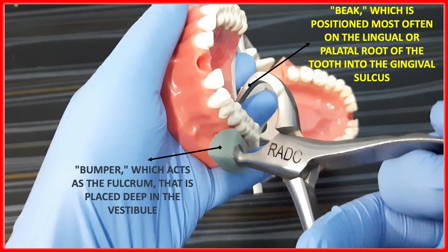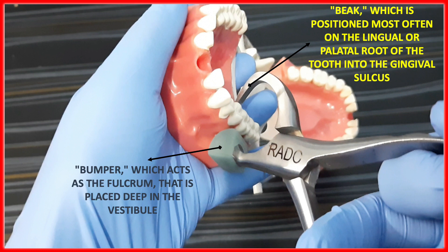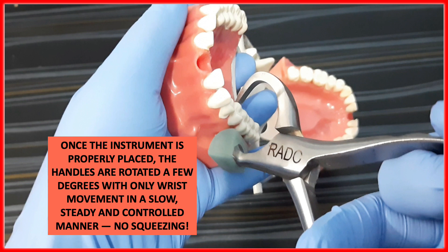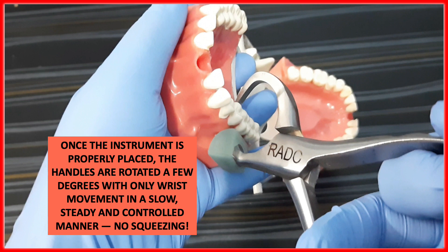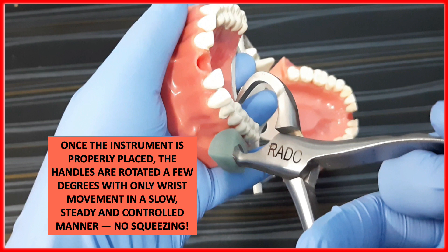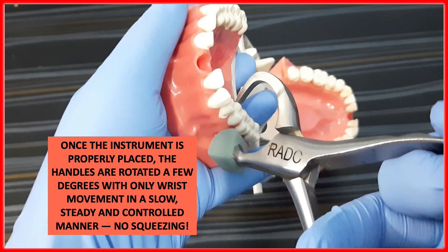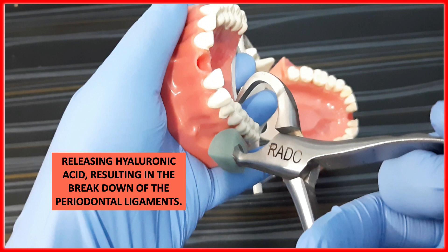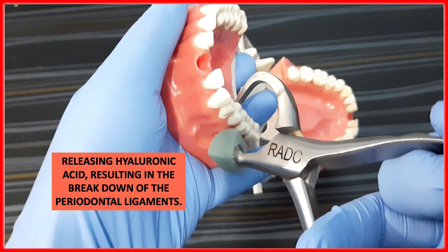Once the instrument is properly placed, the handles are rotated a few degrees with only a wrist movement in a slow, steady, and controlled manner — no squeezing. Remember, there is rotation with the help of the wrist. This will result in the releasing of hyaluronic acid, resulting in breakdown of the periodontal ligament and easy atraumatic extraction of the tooth.